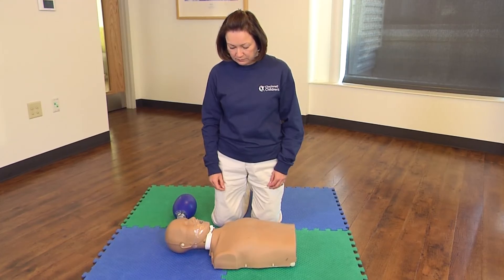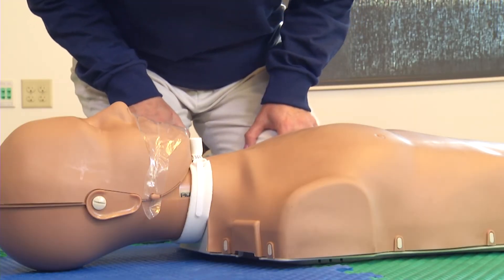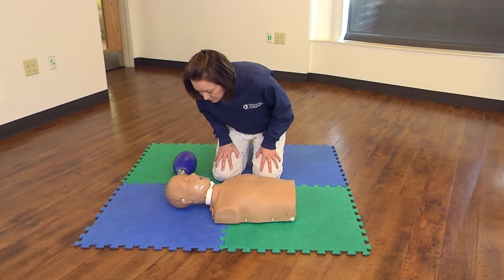Check for breathing and signs of life. Watch their chest for any normal movement. Look for signs of life and breathing for no more than 10 seconds.